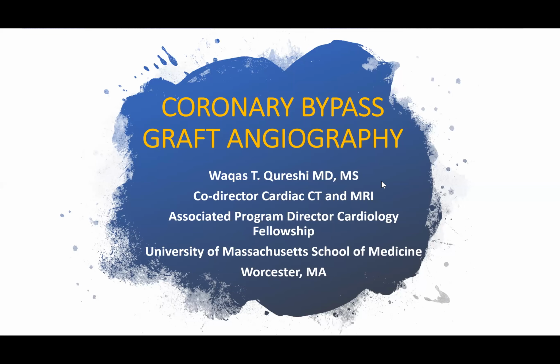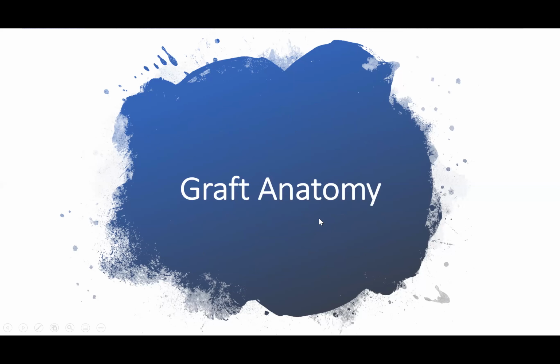So I'm going to start with the presentation on coronary bypass graft angiography. Several fellows have asked me about the techniques and the anatomy because it's a little bit different from a usual coronary angiography. The first most important thing is to actually understand the graft anatomy.